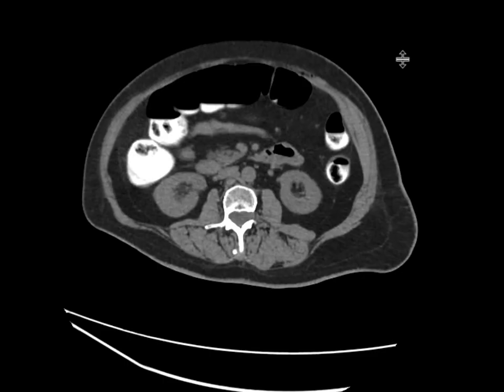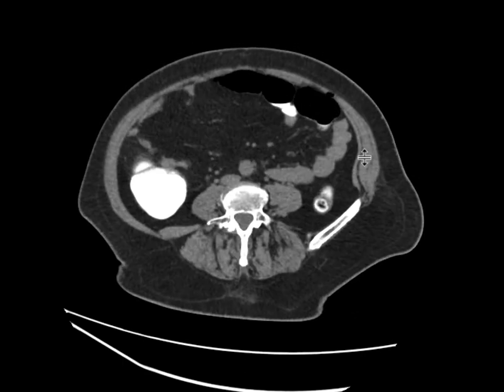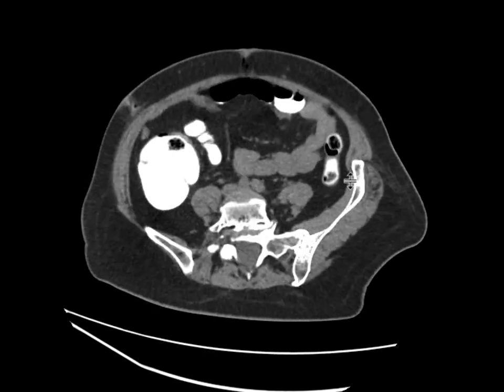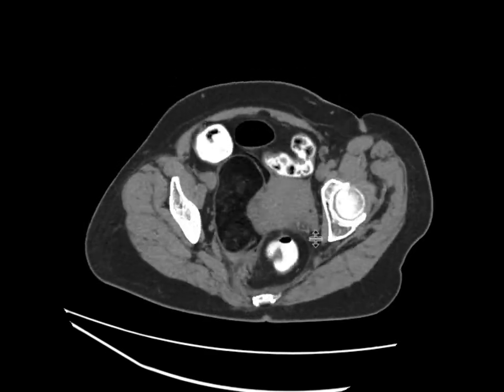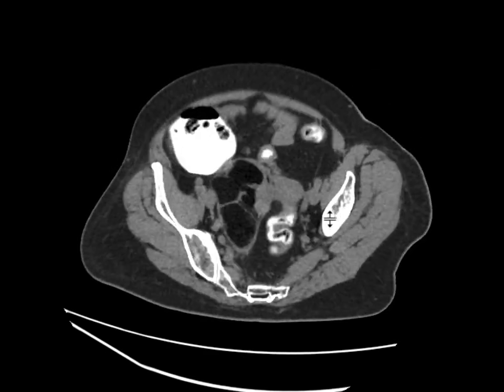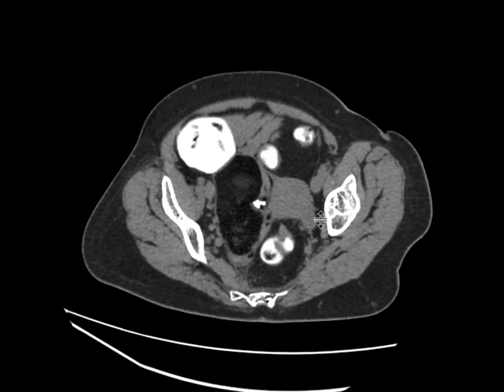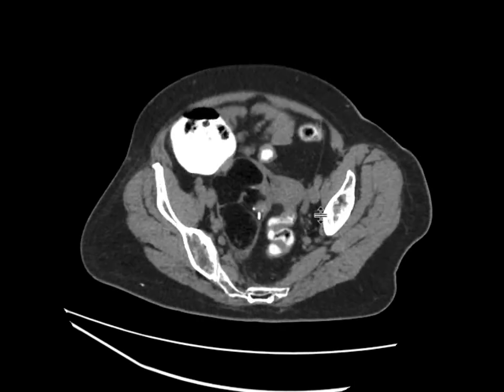This is a postmenopausal woman who comes in with some pelvic pain. We did a non-contrast CT scan and gave her some oral contrast. As we scroll downwards to the pelvis, we can see a very clear abnormality centered in the right side of the pelvis. This large fat-containing mass has a few soft tissue elements within it, and there's a calcification at the periphery of this.